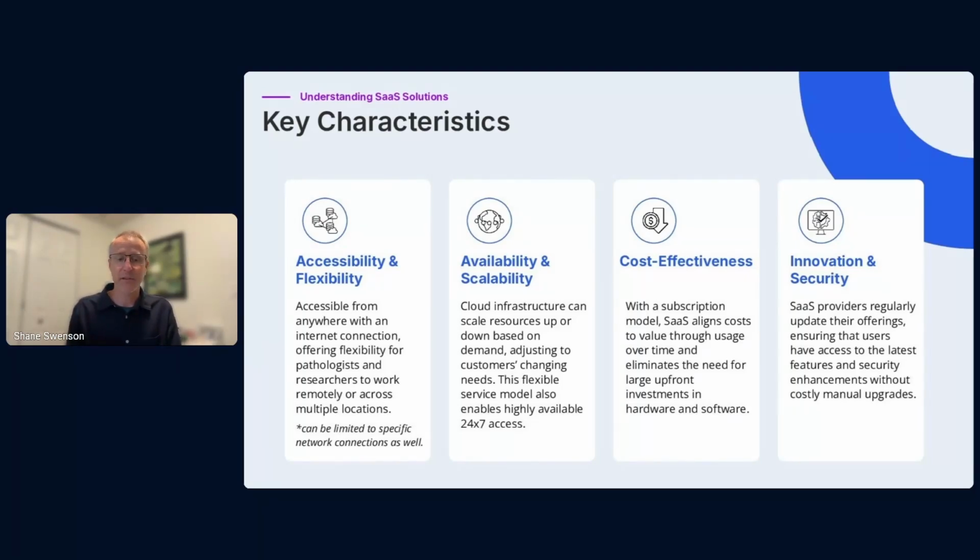This means that the vendors can deliver a pay-as-you-go model where you essentially pay for usage as opposed to paying upfront for potential usage. Again, in on-premise, you had to kind of buy what you needed and then hope you used it efficiently. In the case of software as a service, there is an option to purely pay as you go, at which point your billing is going to be directly tied to your workload, which should be tied to the value and your revenue, enabling you to match that cost to value directly.